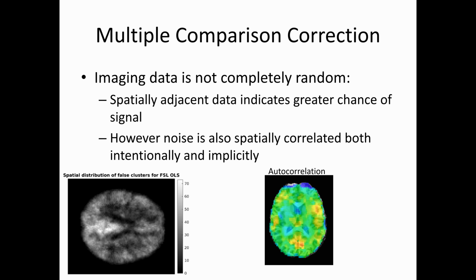This can be, some of it is due to data collection. When Tom went over the data collection and you have your gradient and your phase and all of that, your centroid of your voxel of collection is going to have certain properties, but the ones adjacent will have some of the similar properties just in the kind of signal that they're sending and receiving. But also the internal structure of what you're dealing with has some strong similarities, and you're going to need to account for those as well.